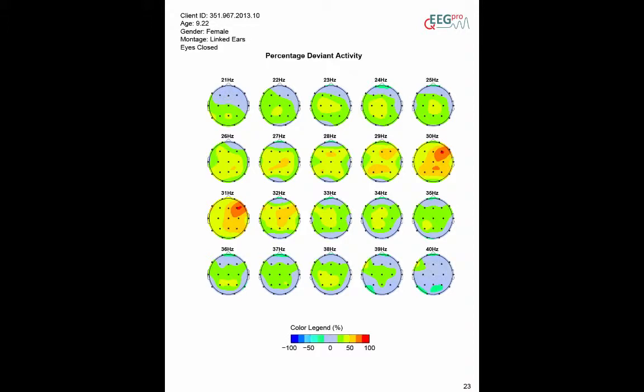If the average z-score is positive for a particular frequency and electrode, the percent deviant activity represents the time that the power is above a z-score of 2.3.